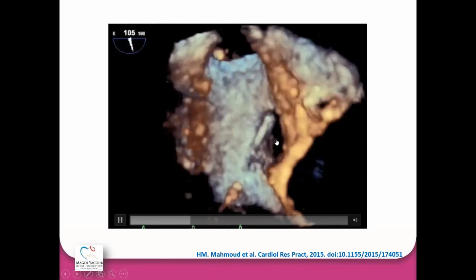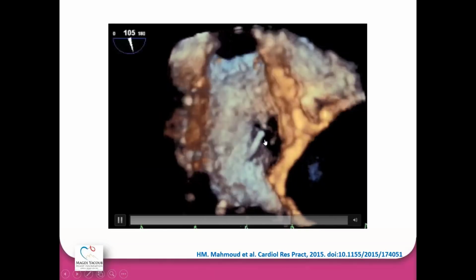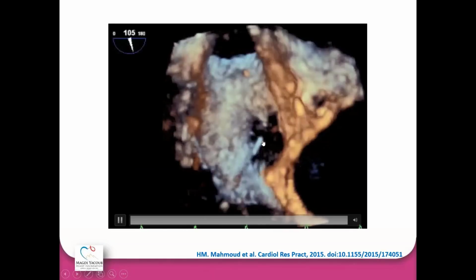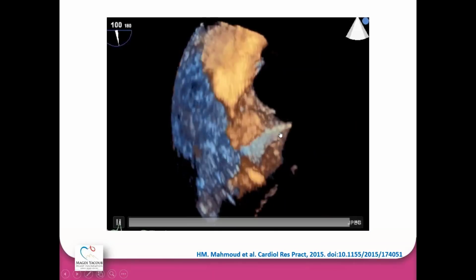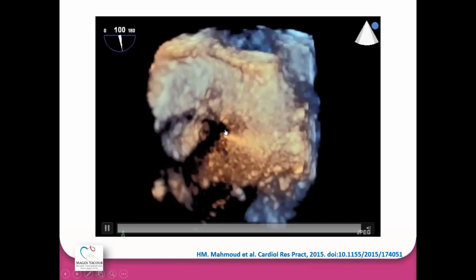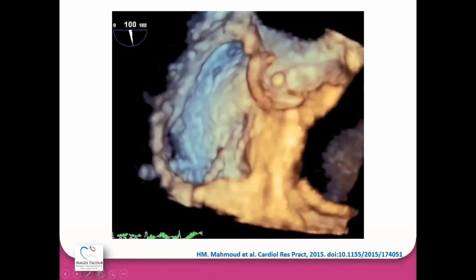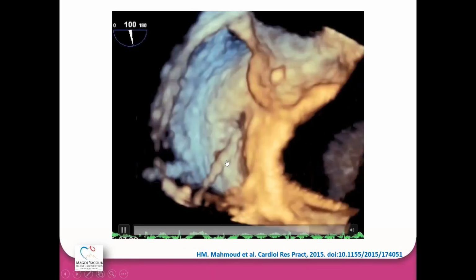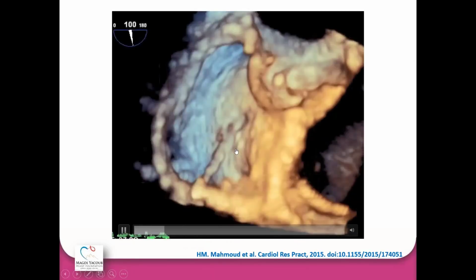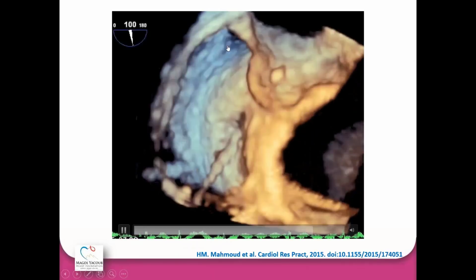This is during the tenting. This catheter was pointing anteriorly, and he rotated clockwise to tent the septum in the middle of the fossa. You can appreciate the tenting by tilting this volume to the right, and appreciate the tent here, and even from the left atrial aspect by tilting the volume more. Here is another patient during the tenting. You can see the catheter impinging on the septum in direct vision. The aortic valve is here, the aorta is here, and here's the superior vena cava.